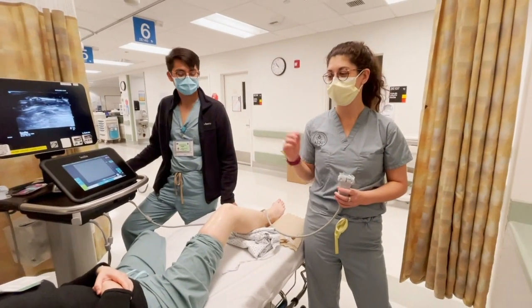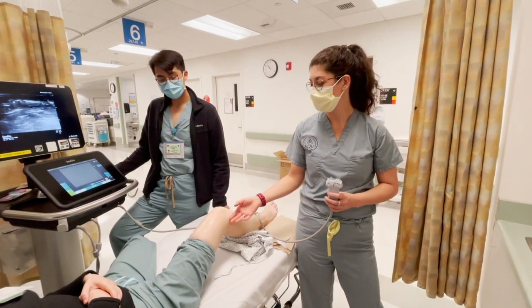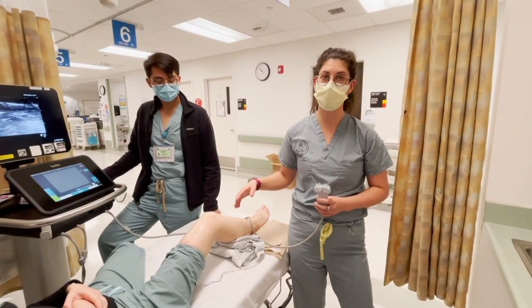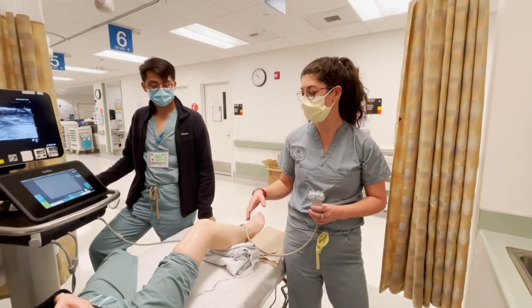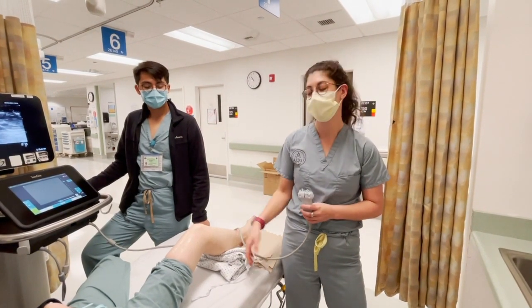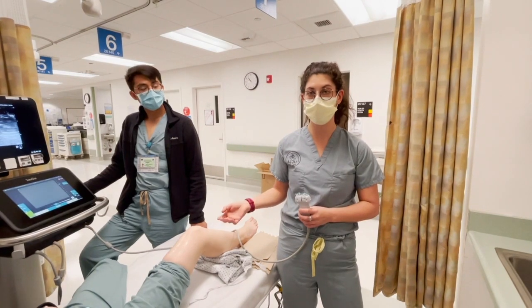We have our 26-year-old female who came into the emergency room for knee pain. We first did a musculoskeletal exam on her to look for active and passive range of motion pain. If she had pain with just active range of motion, we would think more about musculoskeletal pathologies. She however had pain with both active and passive range of motion, so we're thinking more about things going on in the joint space.